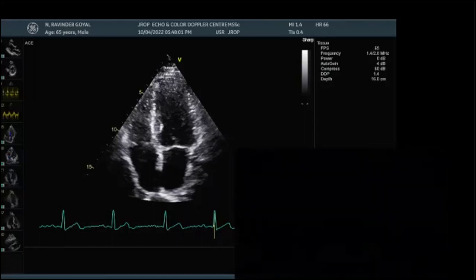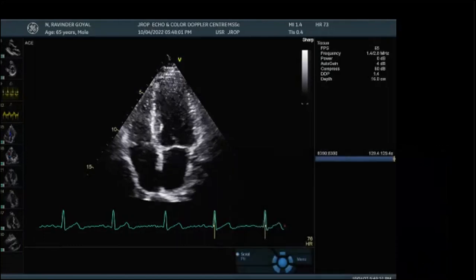You go to the institute icon and double click on it, then you'll see the slides. No, I see you. Please listen to me. Look at the screen. There are a number of icons. One of the icons is the institute. Double click on it.